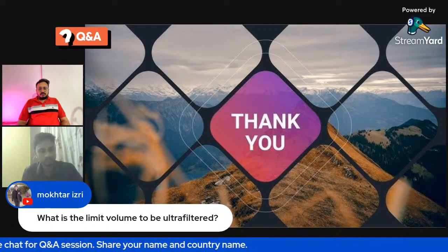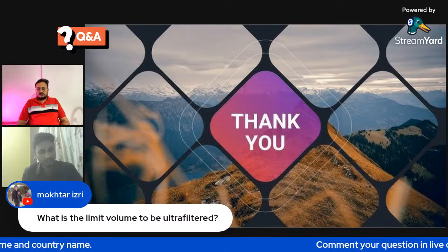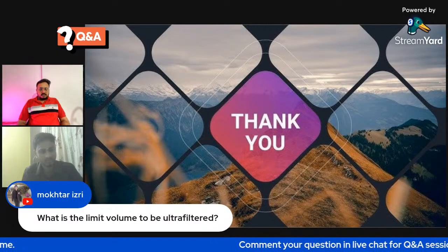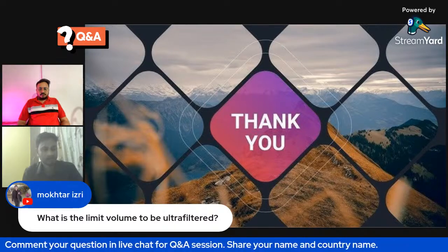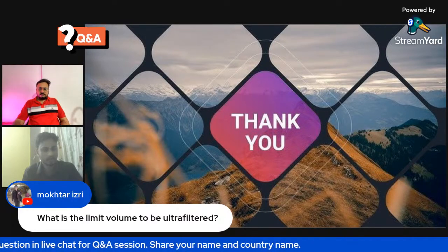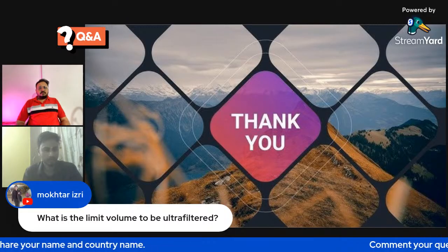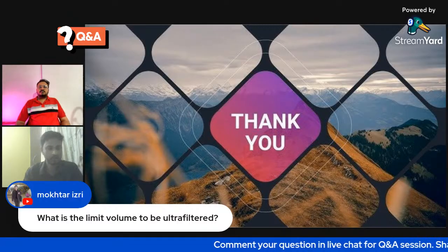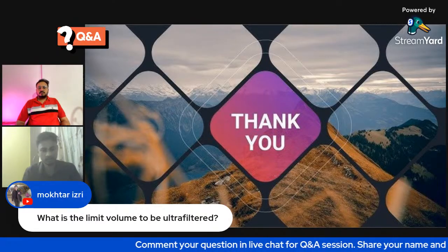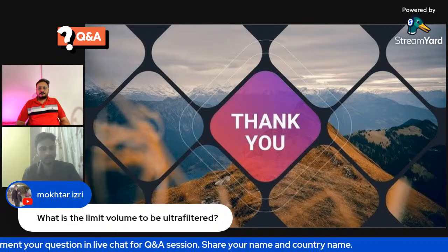We have one more question, from Mokhtar Izri, who is from Algeria. What is the limit volume to be filtered? There is no limit volume, because it depends upon fluid administration and the case in which we will do muff. Sometimes CPB goes 300 minutes also. That limit is not possible to define.